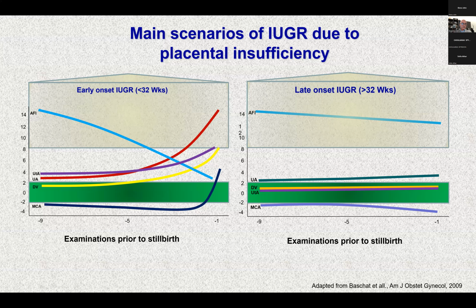You can see the uterine hemodynamic values show increased impedance to flow very rapidly, in the uterine artery and also the umbilical artery. Less evident, we generally have an increase in the umbilical artery, but with not so rapid evolution. You can see here the alteration in the ductus venosus, and the uterine artery is not so evident.